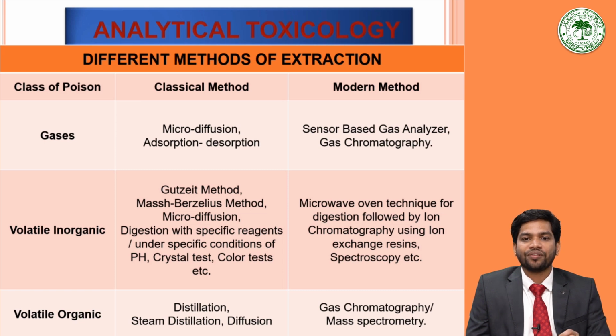The efficiency of extraction and stripping determines the lower limit of detection, precision and accuracy in the determination. So, the analyst plays a significant role in the selection of proper methodology on the basis of different parameters like case history, amount and physical state of the matrices, analytical requirements, and also the infrastructure facilities that are available.